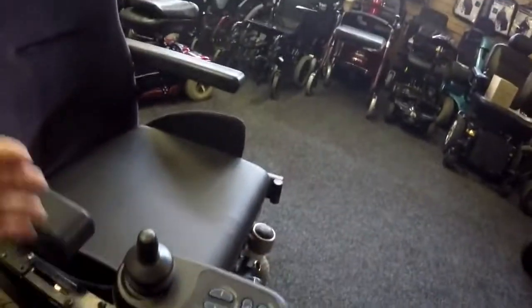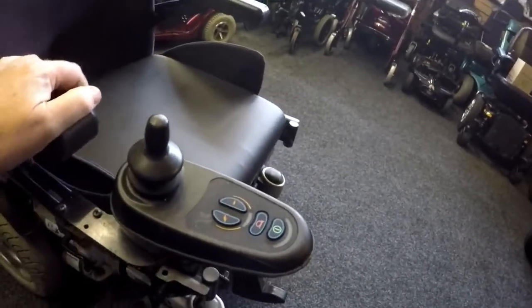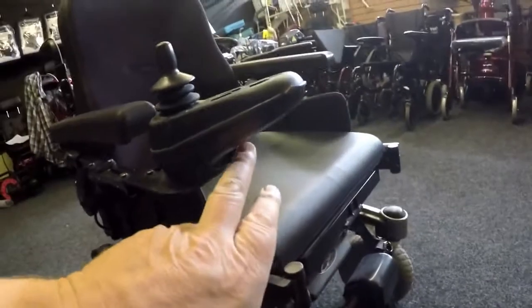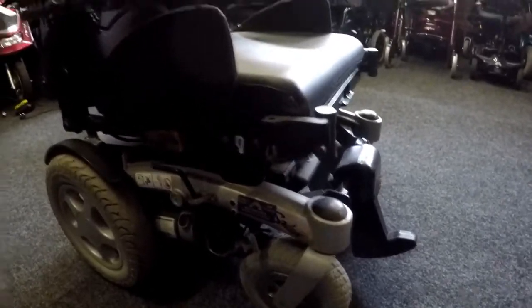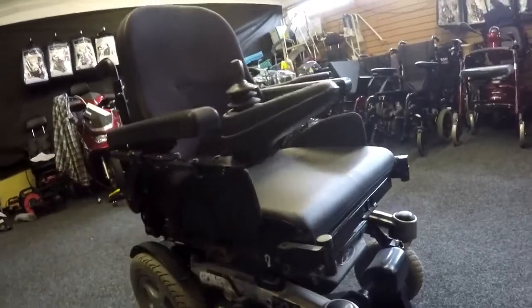Inside here, we'll just replace the joystick. You can get it sent away to get it refurbed, but for the price of it, we just replace it. So what I'm going to do is try the voltage in first, and then if I get voltage, I'll put my joystick on here. Or I could straight away put the joystick on here. I can do that, but technically speaking, you maybe don't have a joystick, so you would check here first.